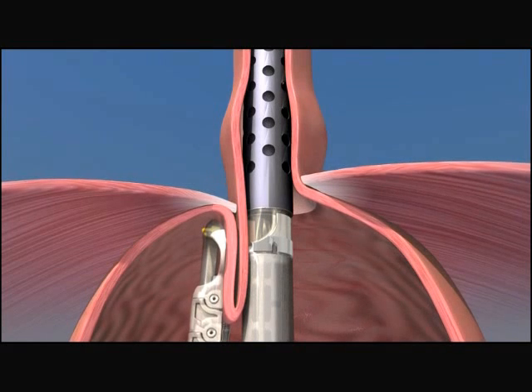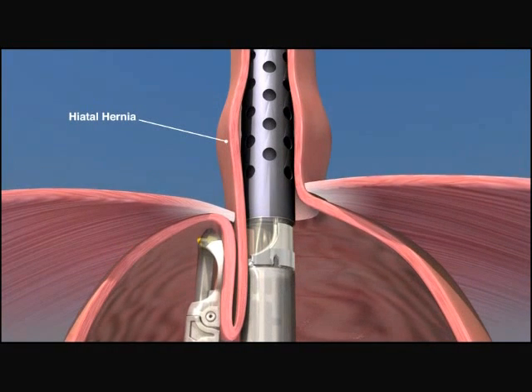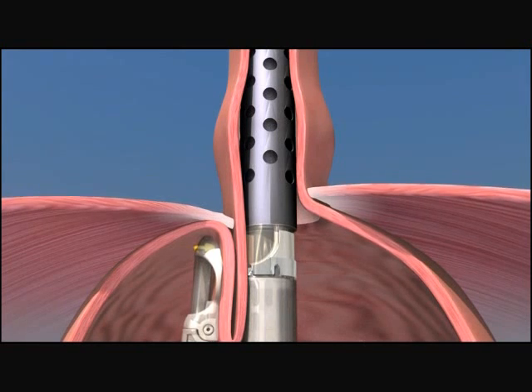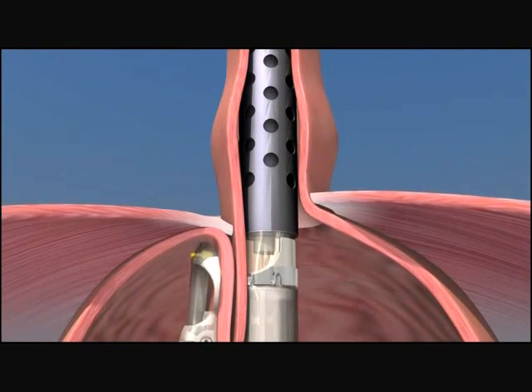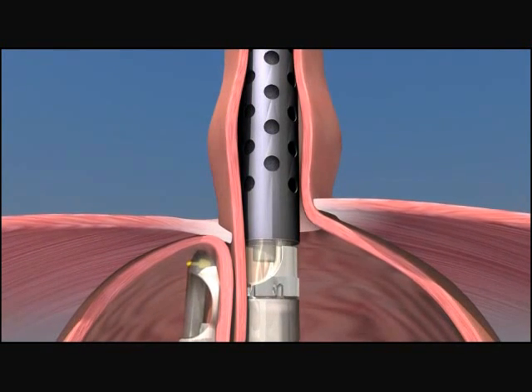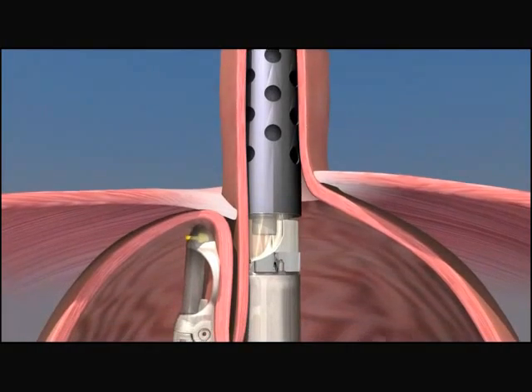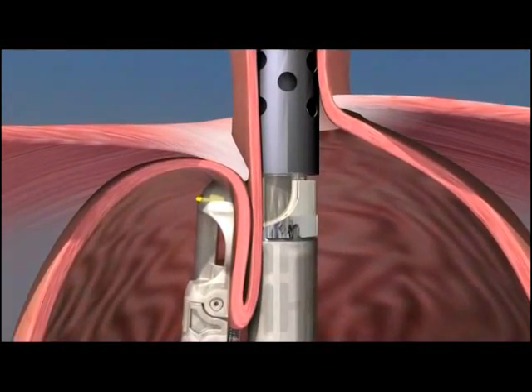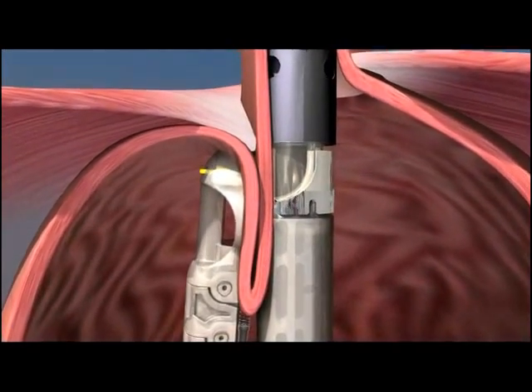Some patients may have a small hiatal hernia, and the esophagus can be lengthened by retracting the endoscope up into the esophagus. Suction is then engaged and the stomach is repositioned down below the diaphragm. The device is then rotated, wrapping the fundus toward the lesser curvature of the stomach.